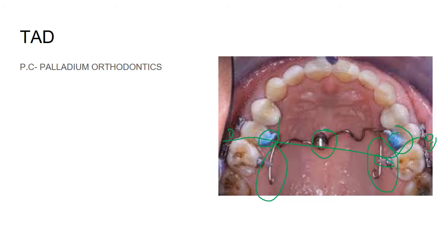Here is an example of a bonded TPA — bonded with composite to the premolar. Since TPA alone is not enough for critical anchorage cases, in this example a palatal implant is placed along the midline for absolute anchorage — achieving 100 percent space utilization. This setup with implants or TADs is used for critical anchorage cases and to intrude the molar.